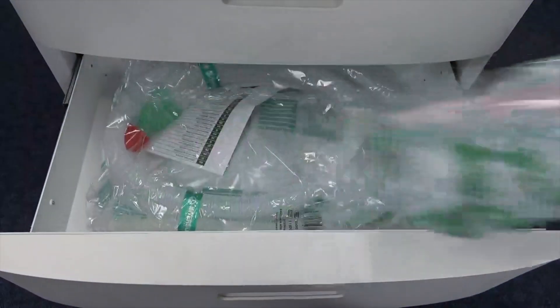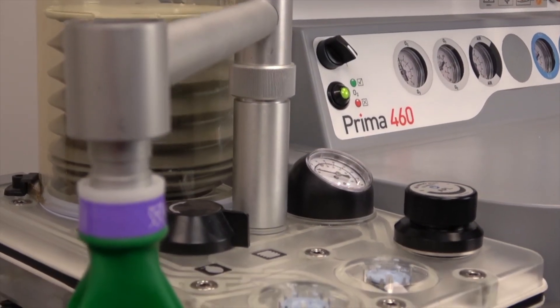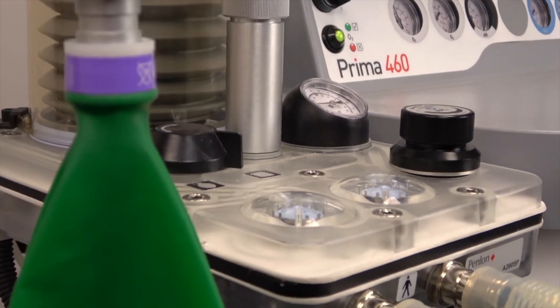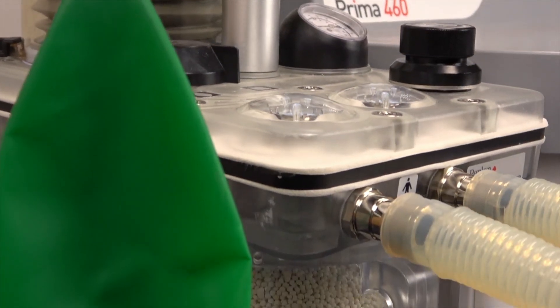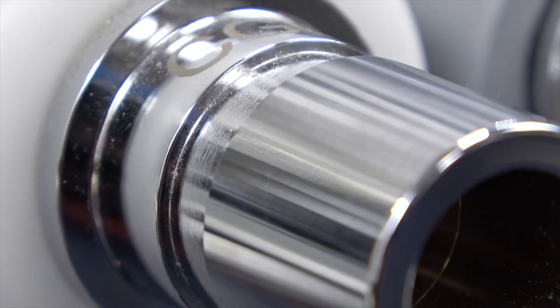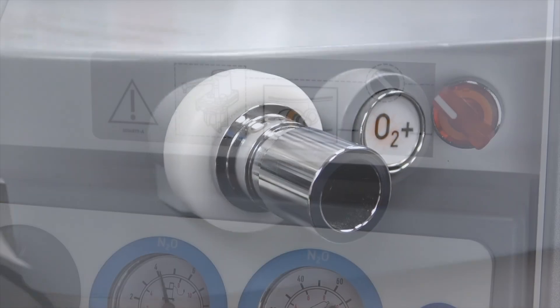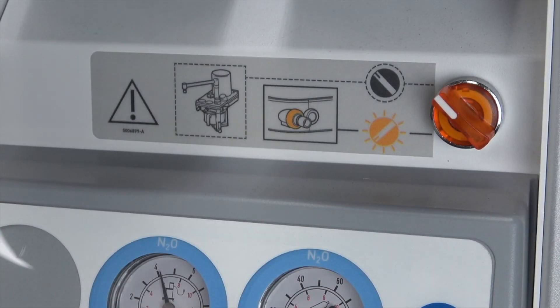There are three large capacity drawers and a sophisticated heated breathing circuit. An illuminated alternate common gas outlet ensures safety and is included as standard.